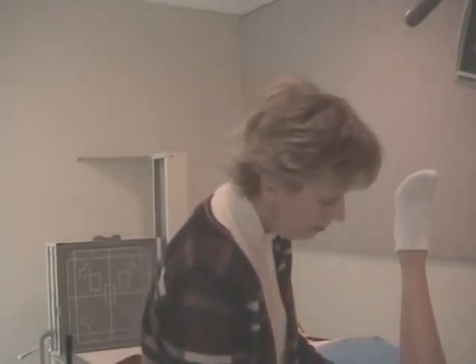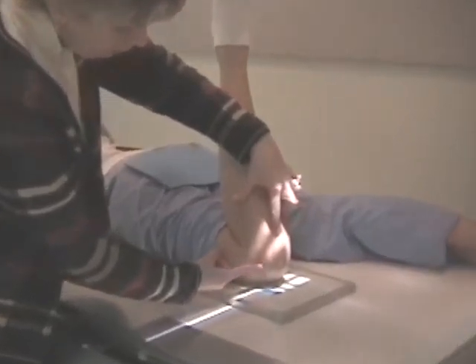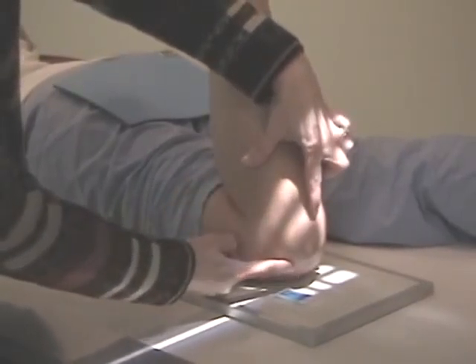And we're back with another alternate way to take the patella. Again, there's multiple ways that you can do this, but in the end result, it's the same approach. Let's look at her knee now. The knee will bend to different degrees depending on the patient. You analyze the position of the patella, and you have your ray coming through that patella at the very same angle as the patella. See this black line?